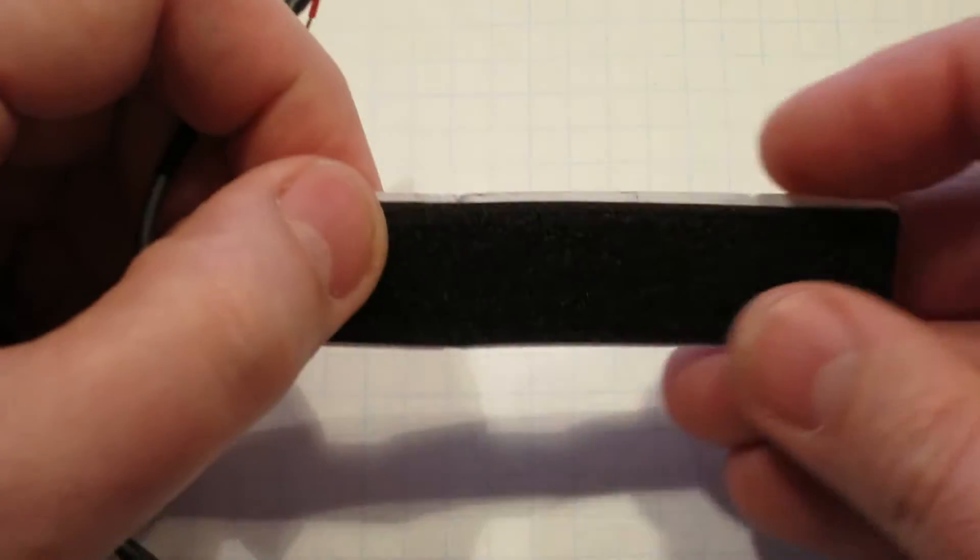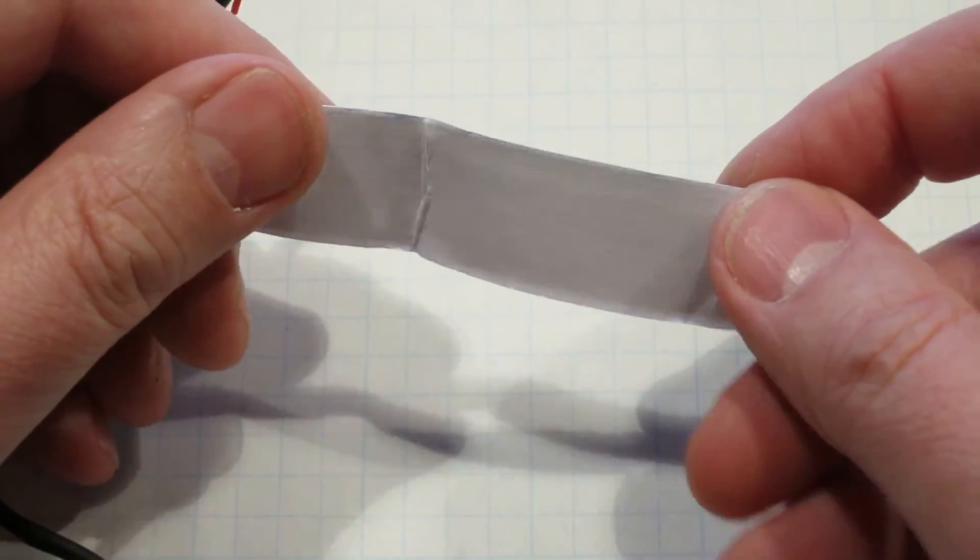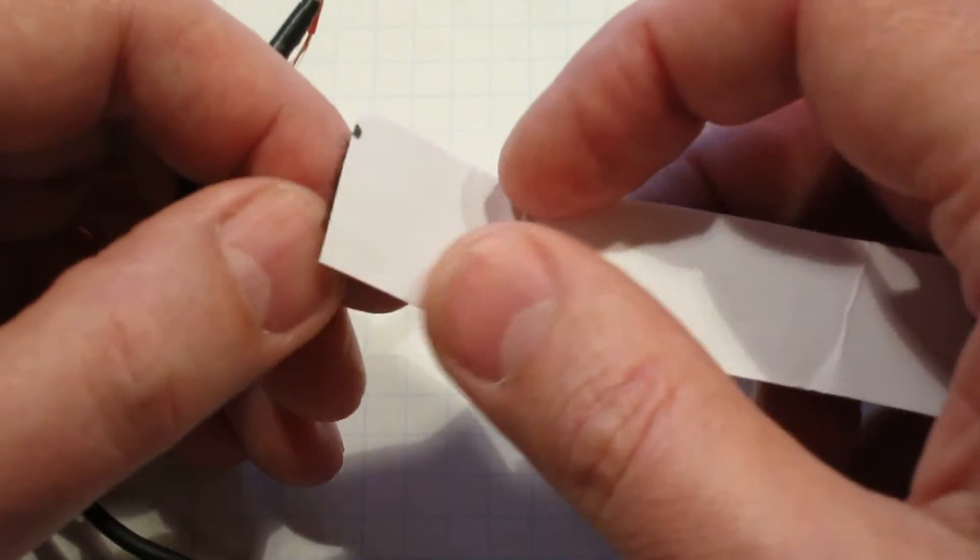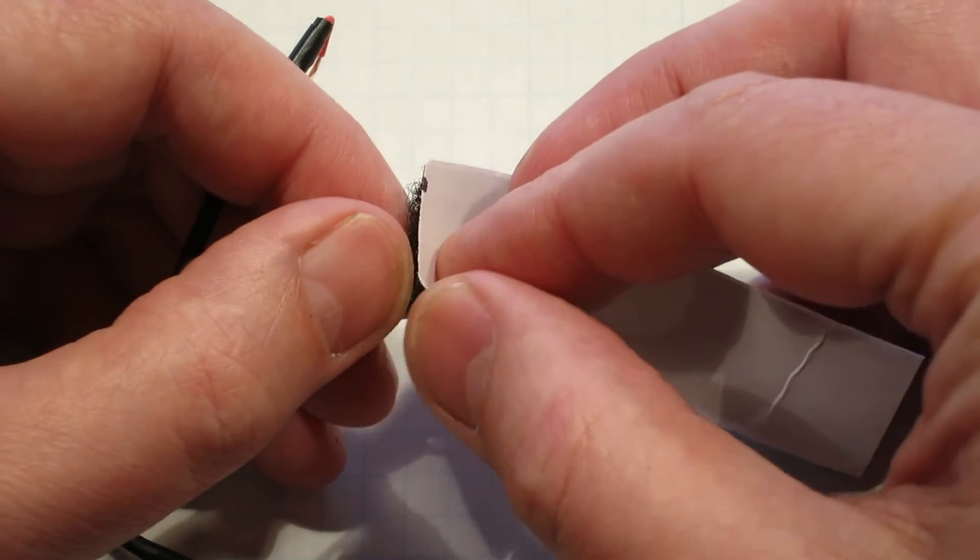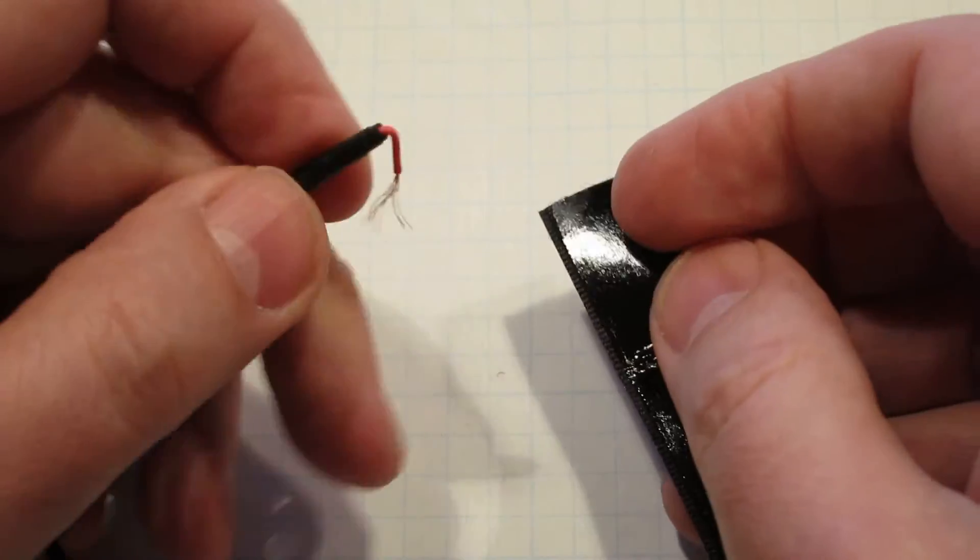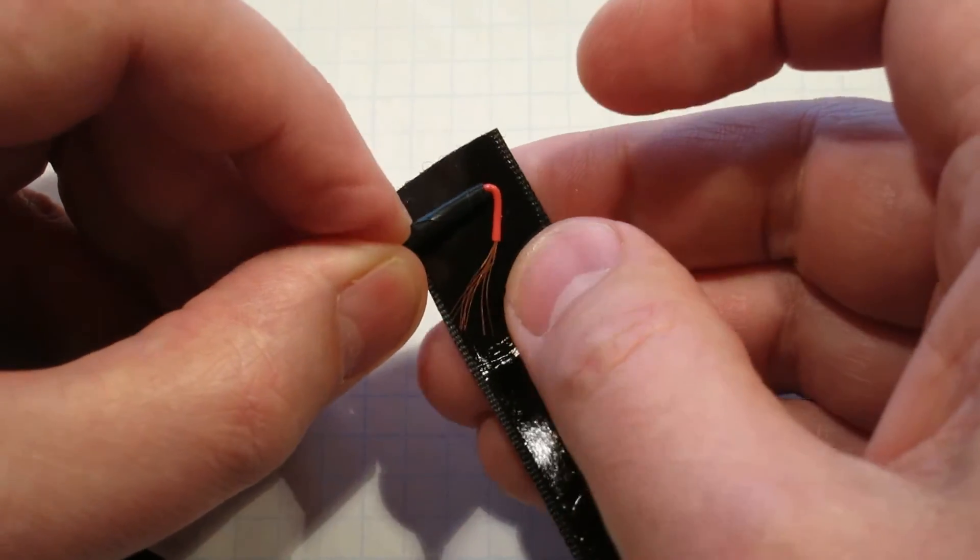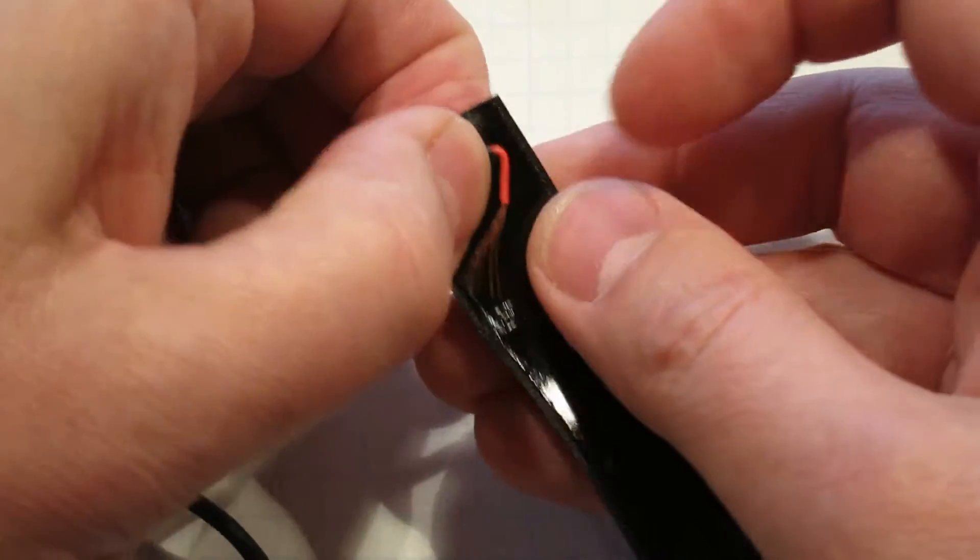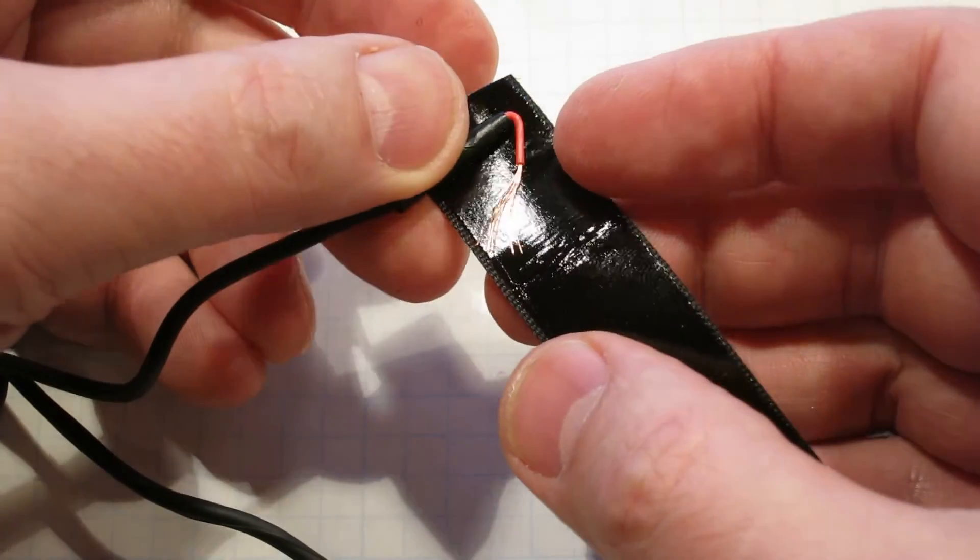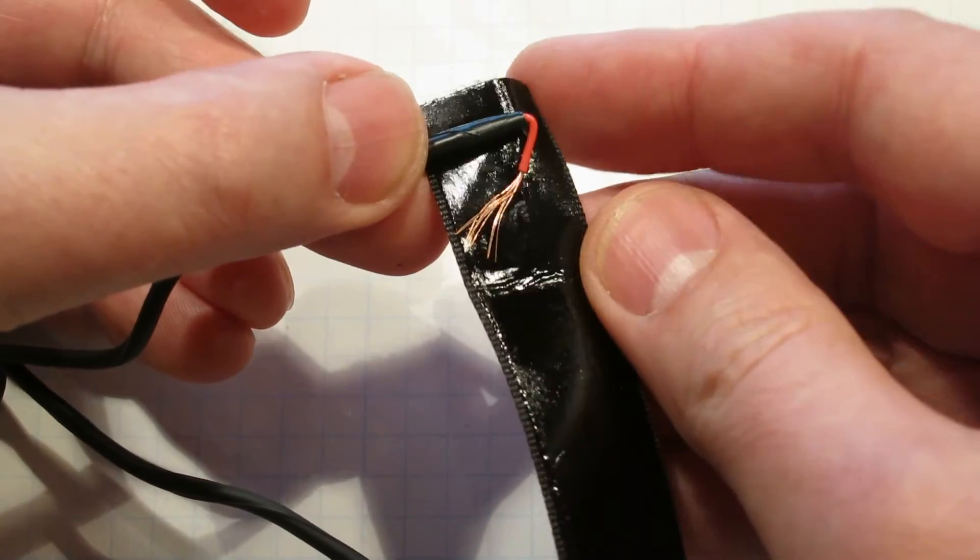Then you take about three inches of the loop part of Velcro. It's the softer part that feels like carpet. Peel this off, and you're going to put the wire in a little way from the end and make sure that strands of wire are exposed like that.